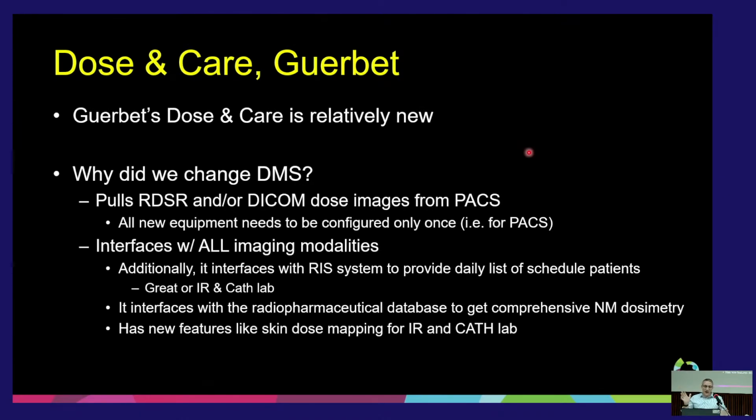All right, so that's just a general broad discussion of different dose monitoring software, all the different features that come with them, things that you should really put in the back of your head when you're trying to decide, do I want one product or one vendor versus another?